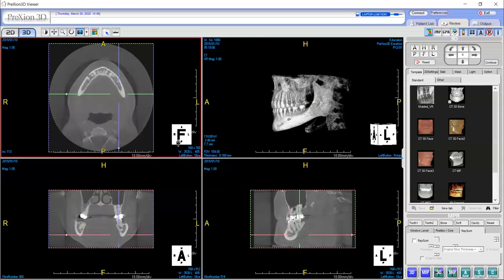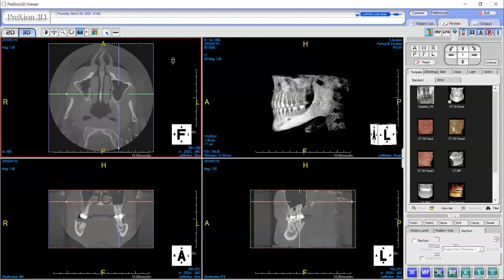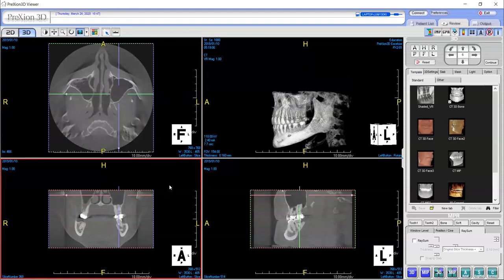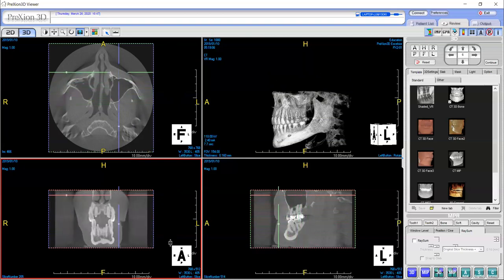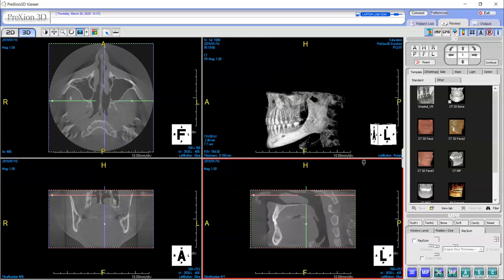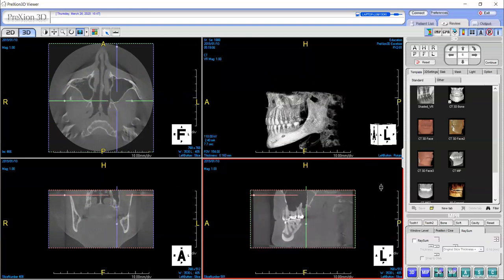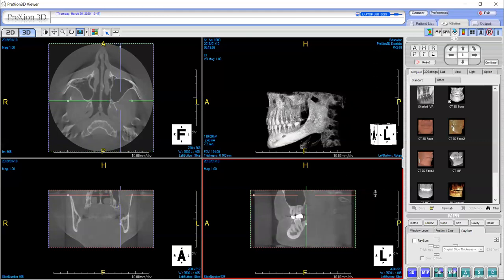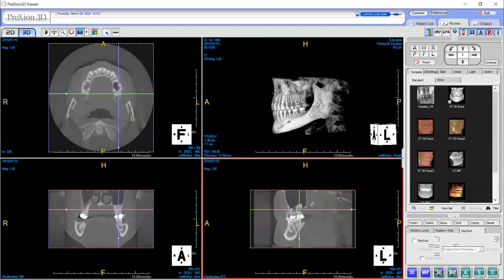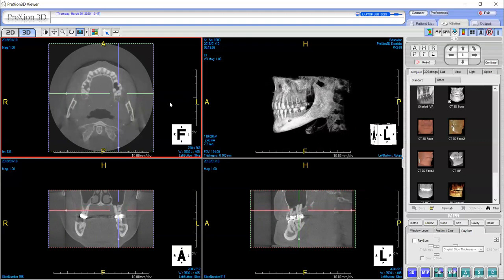In the axial plane, I can go from the mandible — which is considered a foot view — and as I move my mouse up I can travel up towards the sinus. That same function in your coronal view is going to move from anterior to posterior, and in your sagittal it will move from left to right. That is your slice function, which is the default on your left click of the mouse.